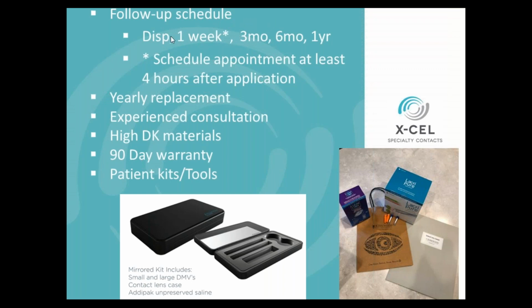On your follow-up visit, so this 1 week or 2 week visit, so that first visit after dispense, an important pearl is to see that patient as late in the day as possible. So we want the patient to apply the lens in the morning, and then you're seeing that lens later in the day. So you're seeing a fully settled lens, probably a fully settled lens for the first time. So you want to make sure you're scheduling that patient later in the day. So now when you do look at that edge, you know that you're seeing a fully settled lens.